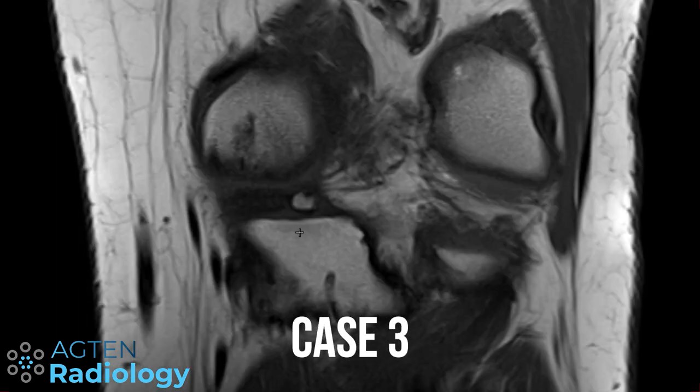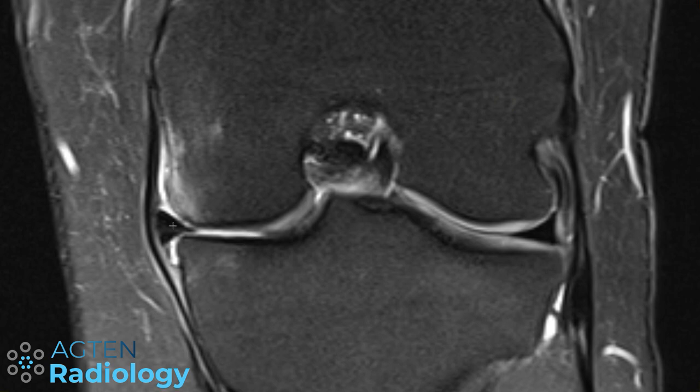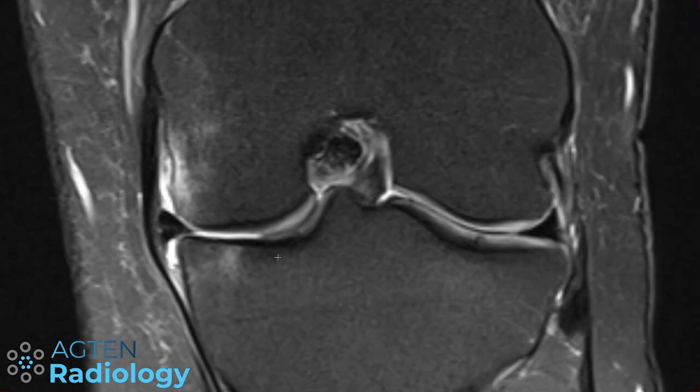So we are still in the same patient, but we are dealing now with the third pathology. If we scroll a little bit more to the anterior portion of the knee, we can see that we have a meniscus extrusion, better visible here. If you measure the distance, it's about 4 millimeters, and everything at 3 or higher is suggestive of a meniscus extrusion. If you see this, you have to be very careful not to miss a meniscal root tear or something like that. So let's go and have a look.